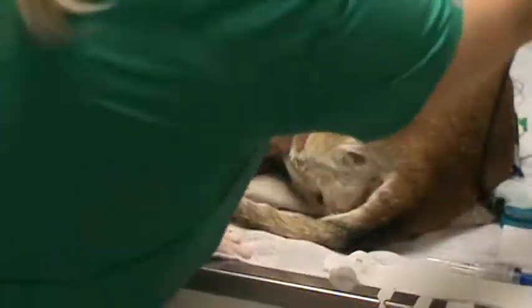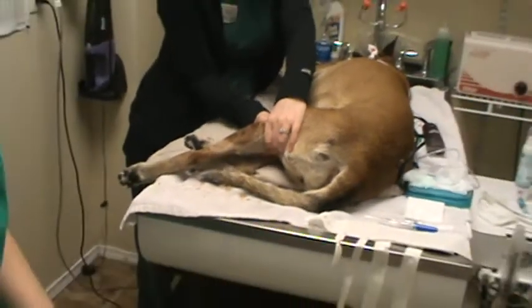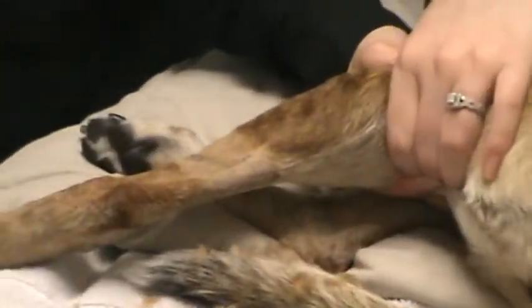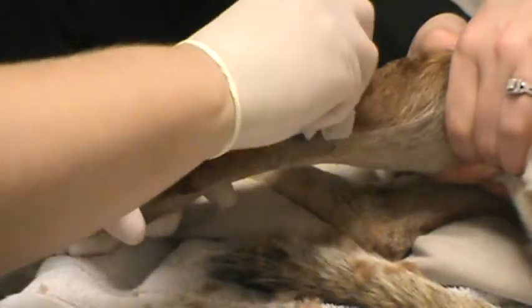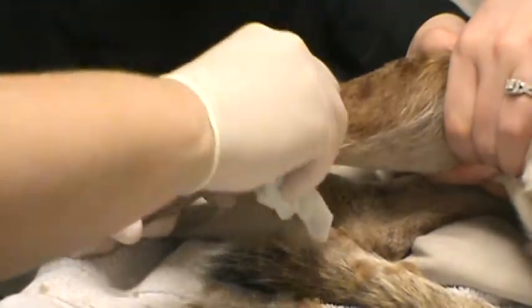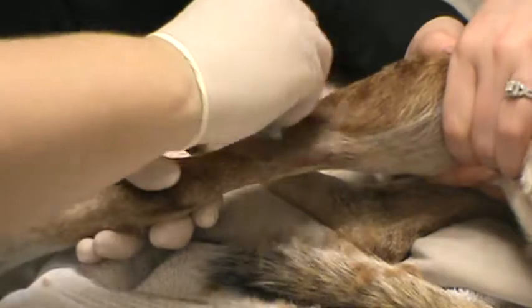Okay, so I have our area clipped here. I'm going to zoom in. Okay. I'm going to go ahead and start the scrub. I'm starting in the middle as a bullseye. Holding her back, not touching the outside and coming back in, only touching the inside and then moving out.